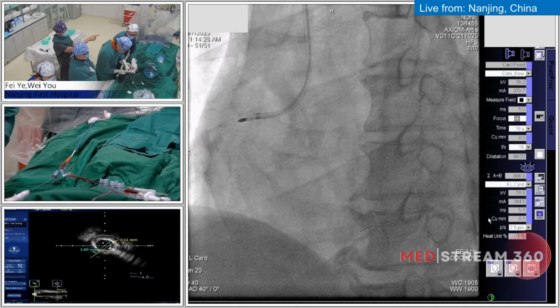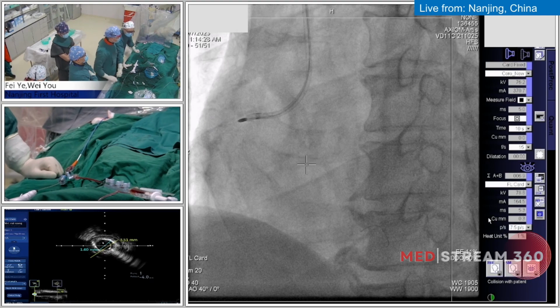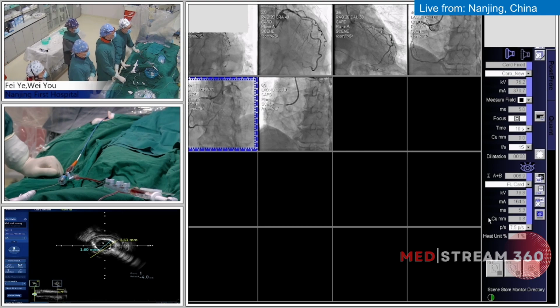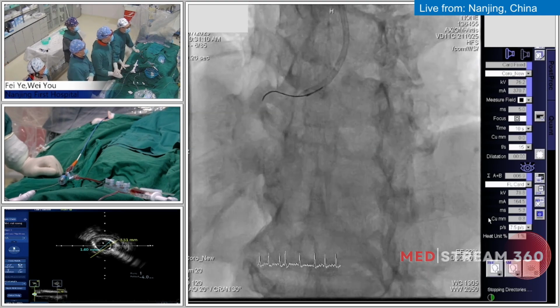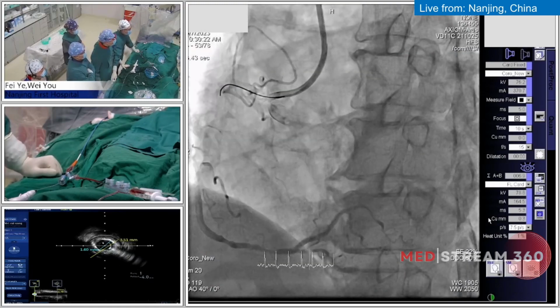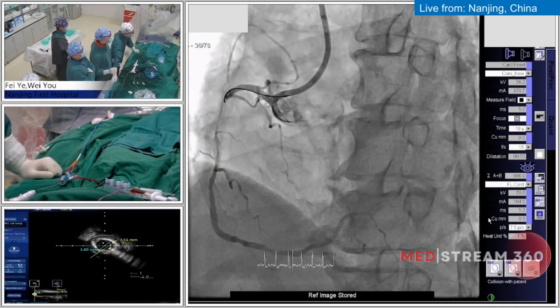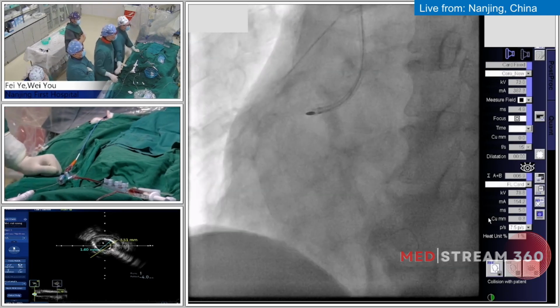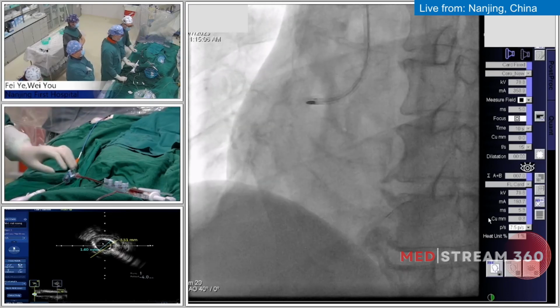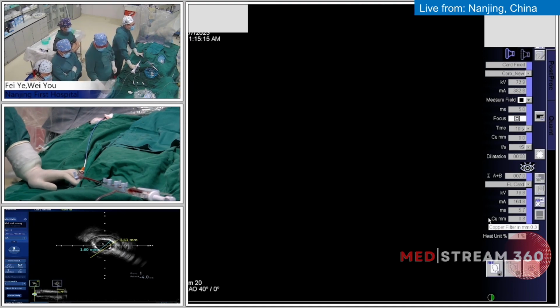No, stop. Use the RCA angle. Please give us the zoom, frozen there. Yes, this one. Okay, reference. Give us a clearer view. You may make sure the rota distance from here to there. Yes. So we will start. Is it high speed? Yes, this is high speed. Okay, we'll perform the first rota.